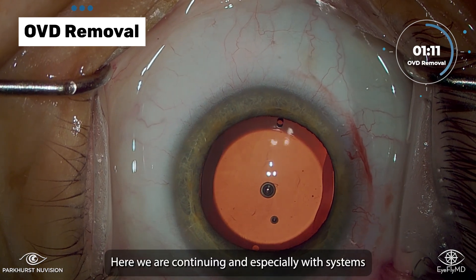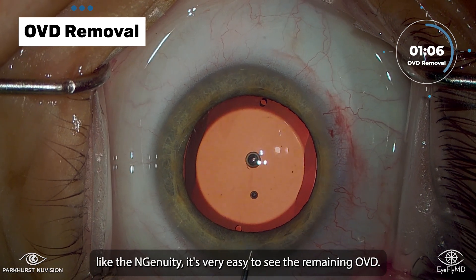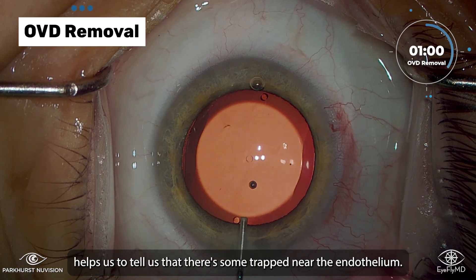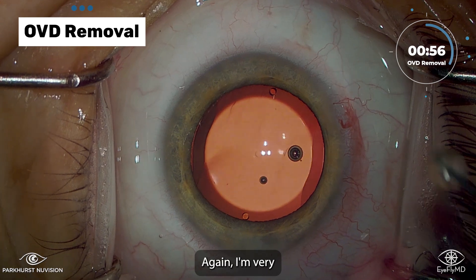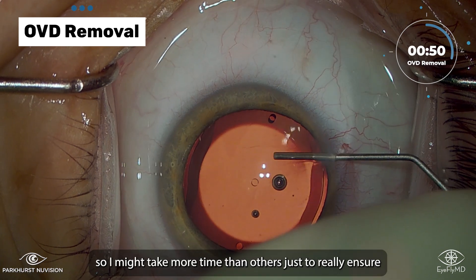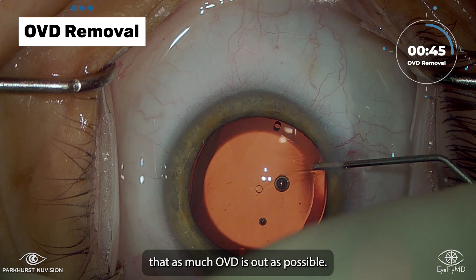Here we're continuing, and especially with cameras like the Ingenuity, it's very easy to see the remaining OVD. There seems to be a little bit near the endothelium, and that bubble helps tell us that there's some trapped near the endothelium. I'm very diligent about not having any pressure problems after surgery, so I might take more time than others just to really ensure that as much OVD is out as possible.